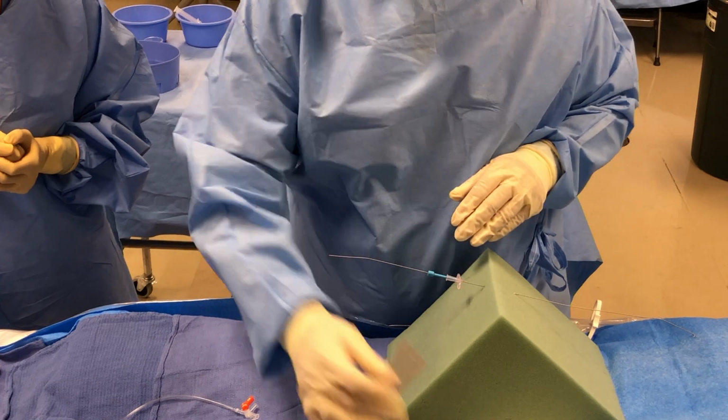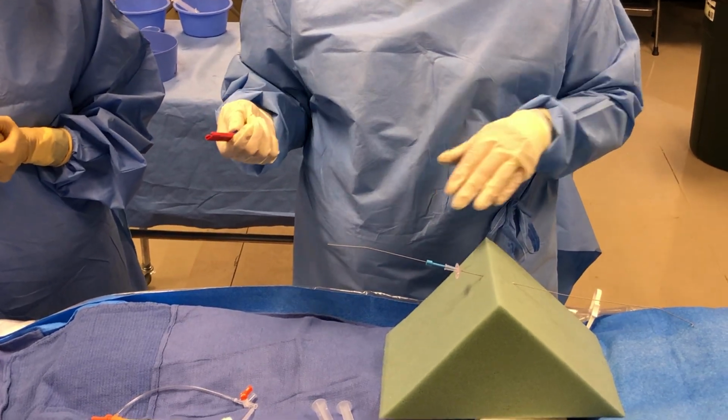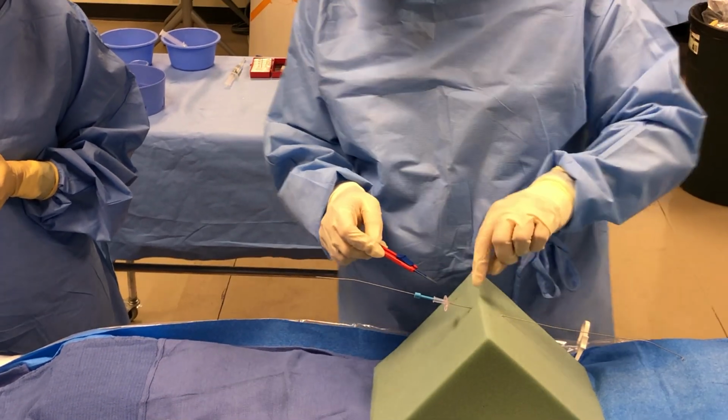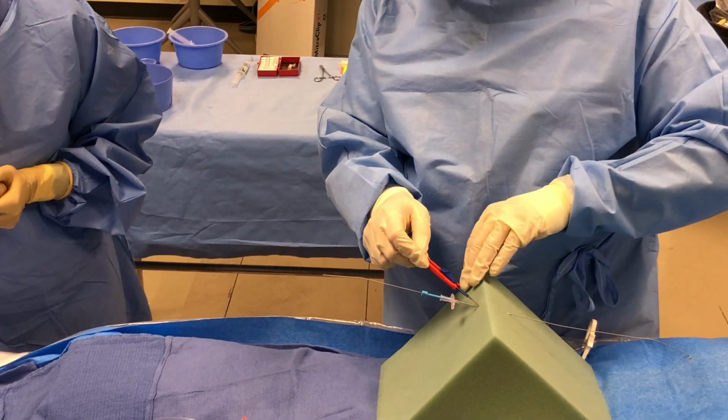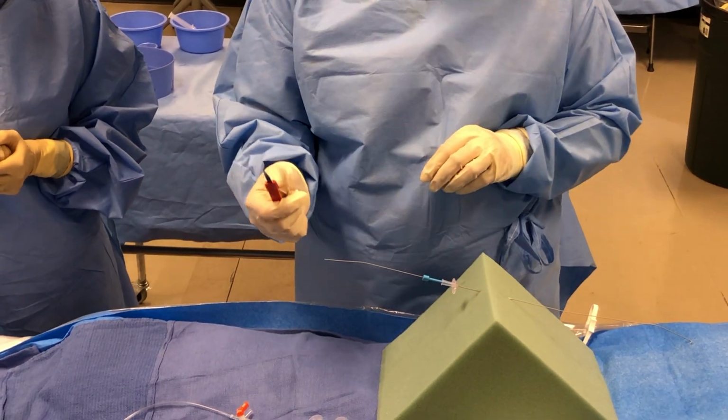This is a good point where they could make their little nick in the skin, okay? Make their little nick in the skin. It goes right where the needle's going in the skin. Again, it's just opening up that tissue tract just a little bit more.